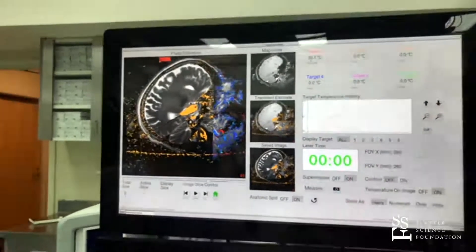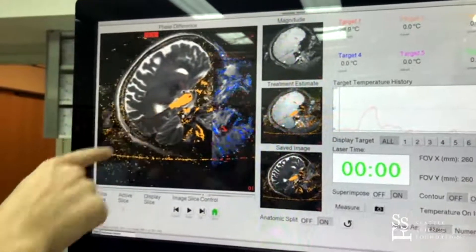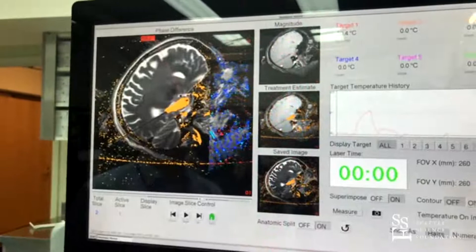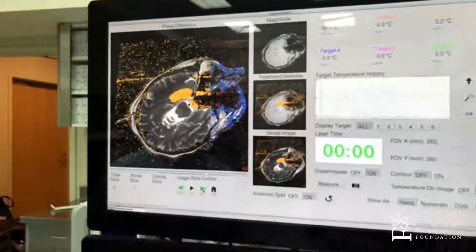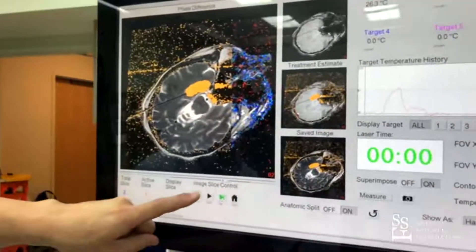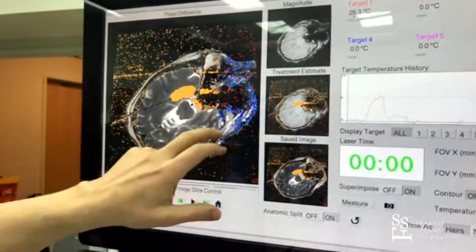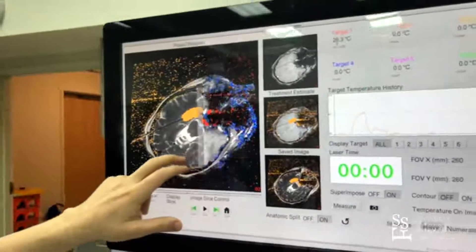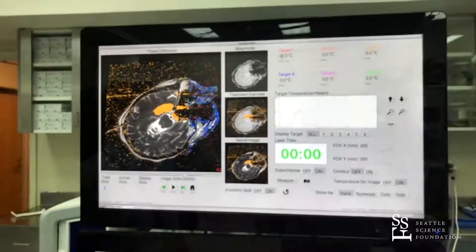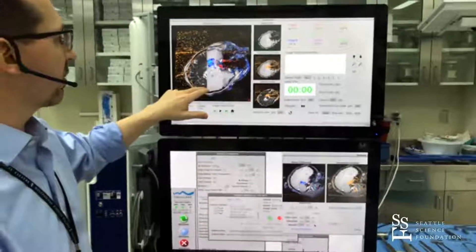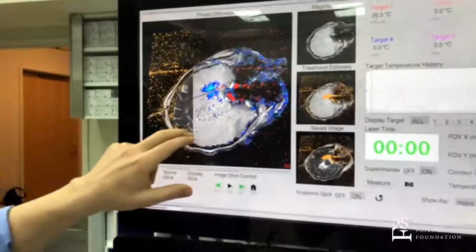Just above the hippocampus is the lateral geniculate body and the thalamus, so we're watching that very carefully. We can put safety thermal markers along that and monitor its temperature to make sure it's not heating up. We can also look at this in different views — axial, sagittal — going back and forth and viewing different slices or windows simultaneously. Normally this part of the procedure takes about 10 to 15 minutes of ablation, with about three to six minutes of ablation at each location in cycles of three minutes. This is what we've accomplished by ablating in three different locations with two pullbacks, and you can see the final estimate of damage created in the amygdala hippocampus.